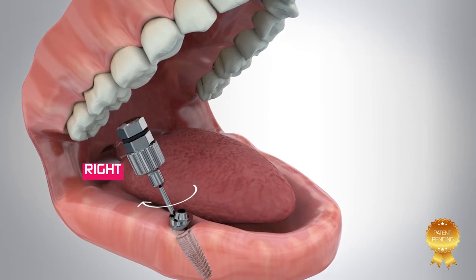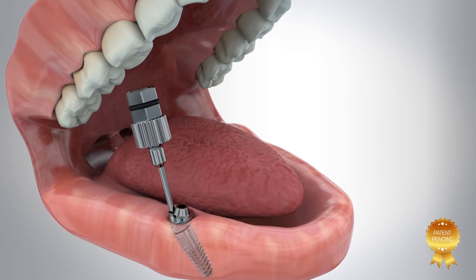Place and tighten using the angulated multi-unit key to 25 newton centimeters.